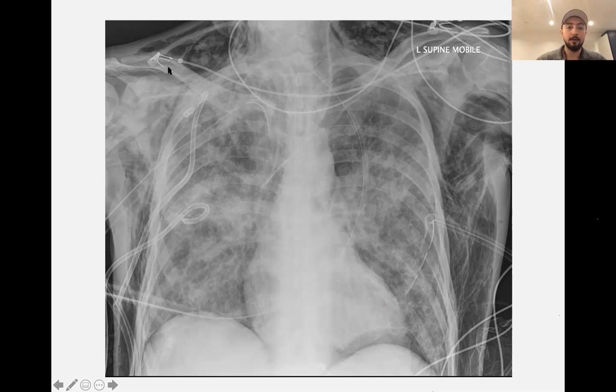So that's air trapping inside the tissues, and that's caused by surgical procedures or, for example, from trauma. As you can see, this patient has a lot of drains inserted in him. So this could be the reason why he has this surgical emphysema.